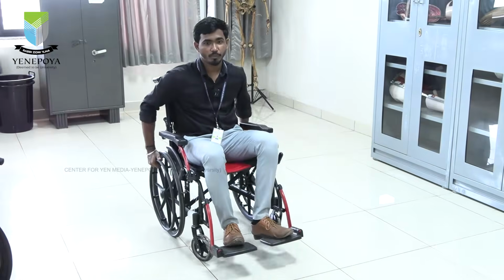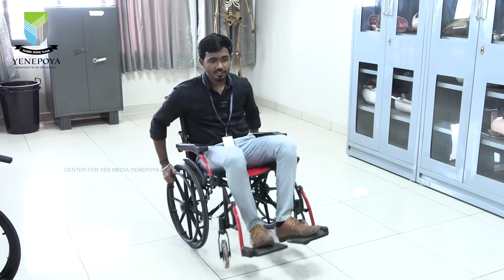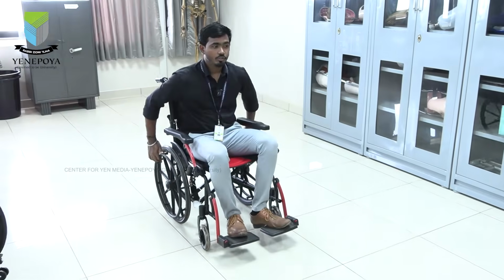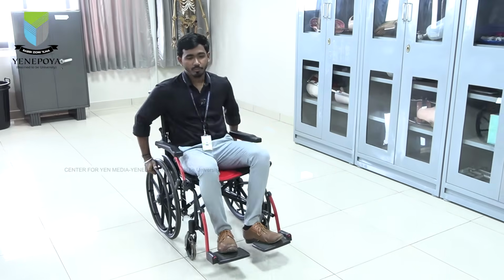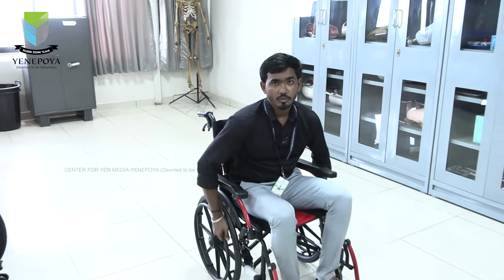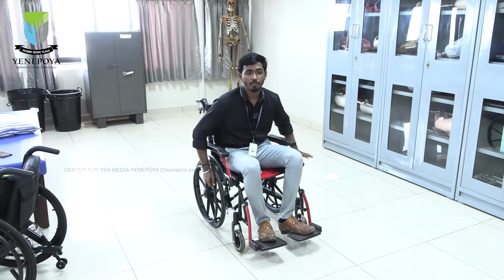So that is called pop-up. Just lift like this. Okay. You just have to give pressure and lift the front caster wheel and go. Why it is very much needed is, if there is any threshold kind of thing in our home, the person can pop, push, and move forward. So that is the main thing. Before going into wheelie, definitely the person has to do this pop-up.